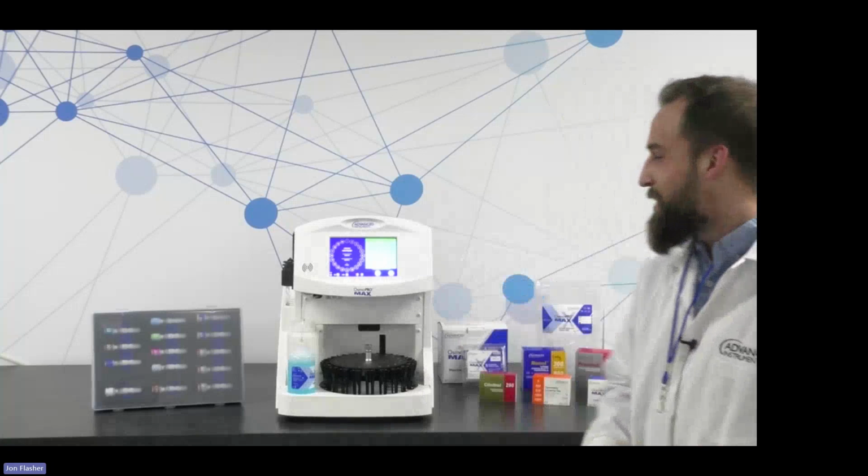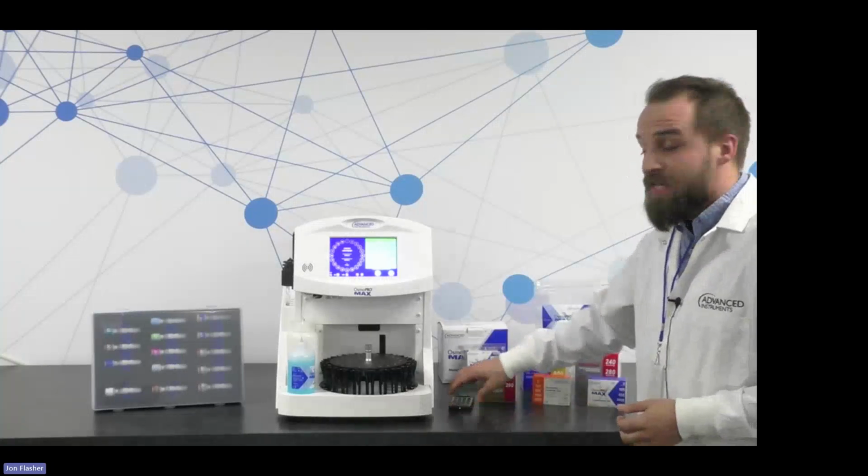But with the last few minutes that we have here in this very quick 30-minute session, I just wanted to open it up for any questions from the folks on the call so that we could address those as well.